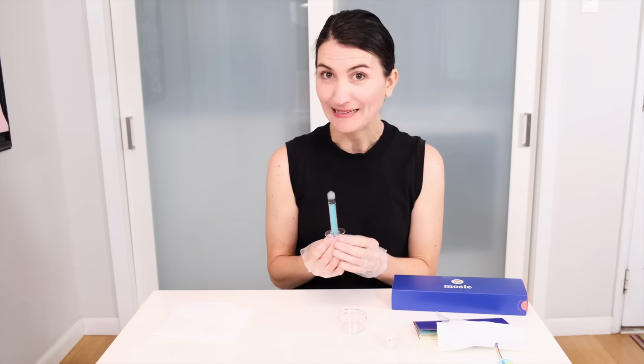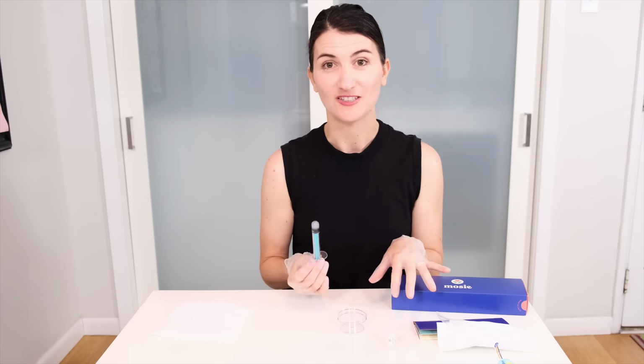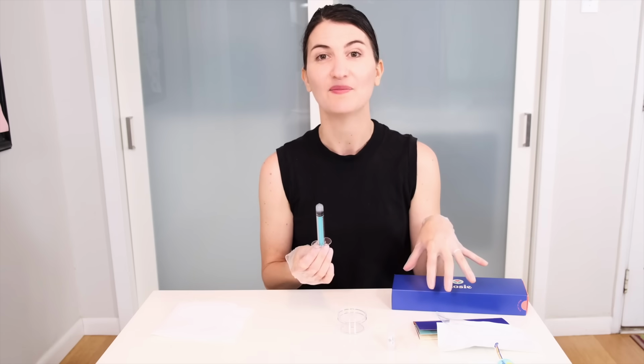So at this point, this is where the fun stuff really happens, right? You're gonna take this to your private location, your comfortable spot, and you're gonna follow the insemination instructions, either included in your sperm bank's kit or the Mosie kit. And from there, I wish you luck. Quick note, a few things to think about. Prior to doing this, you obviously want to check with your doctor, your local laws, see what's happening there. And as well, like I said, make sure you're ovulating, make sure that the timing is right.